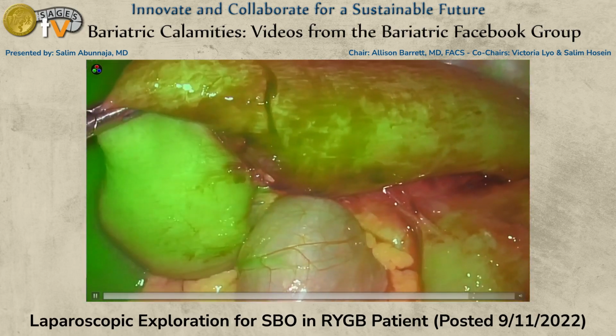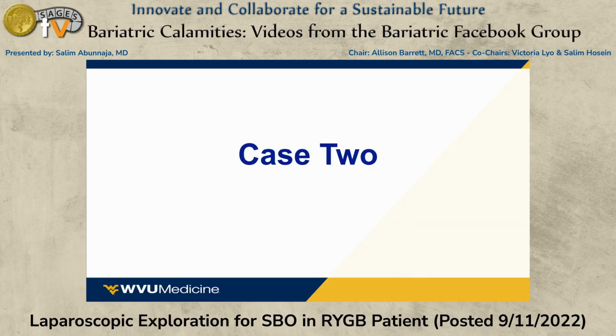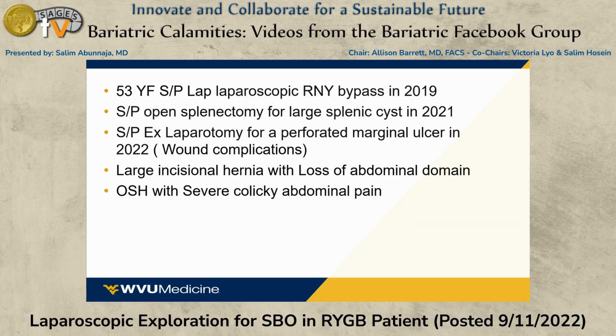Let me just fast forward through this. And that's that. So for the sake of comparison, I present another case, which is case 2. This is a different story. A 53-year-old lady, laparoscopic bypass in 2019. However, she had an open splenectomy with a large splenic cyst. She also had an X-lab for a perforated marginal ulcer, but per history, it was very complicated. She had a wound vac. She ended up with a very large incisional hernia, loss of abdominal domain, and all this was done in an outside hospital.